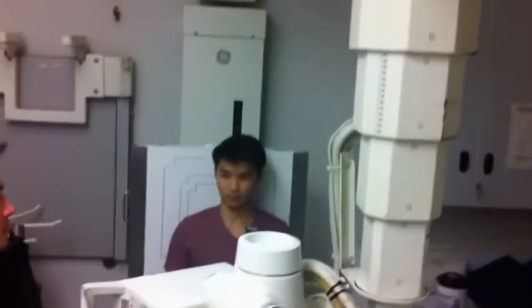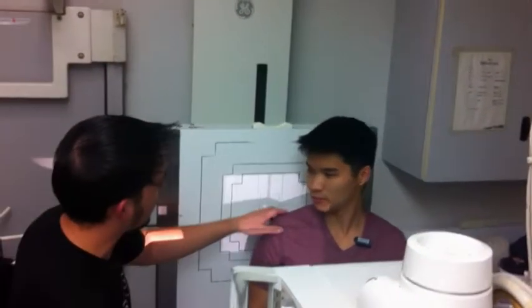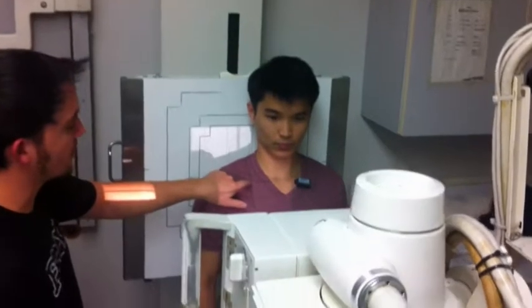Then we are going to fix our vertical here. So what you're going to do is put the CR right 1 inch inferior to the coracoid process. So it looks like we're going to move him a little bit over that way.